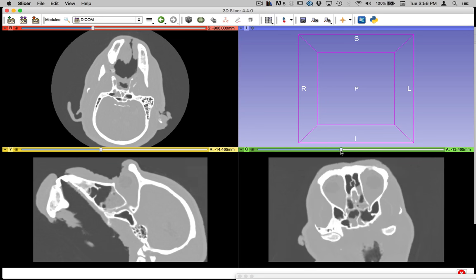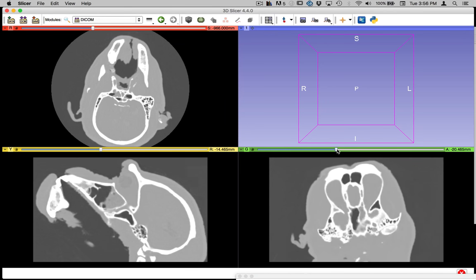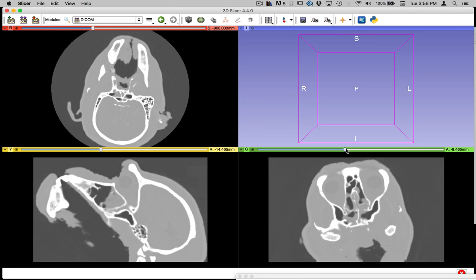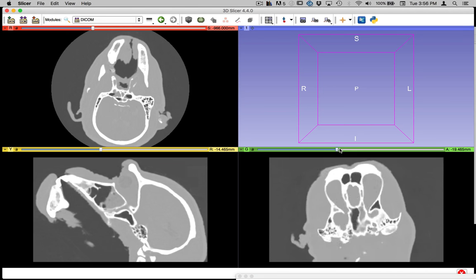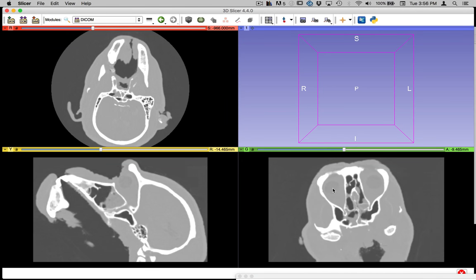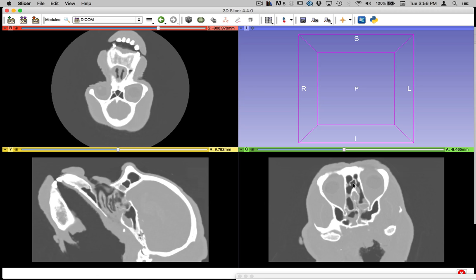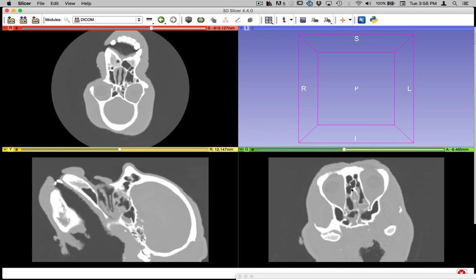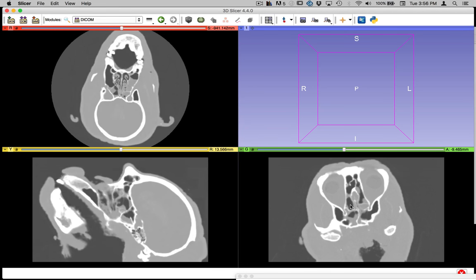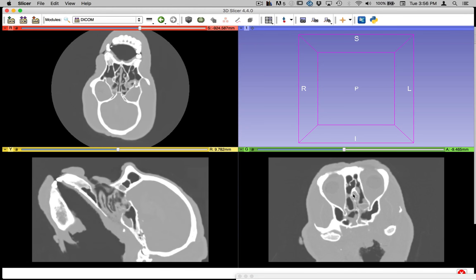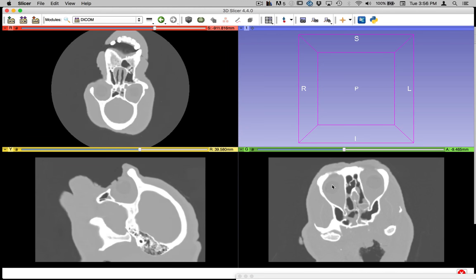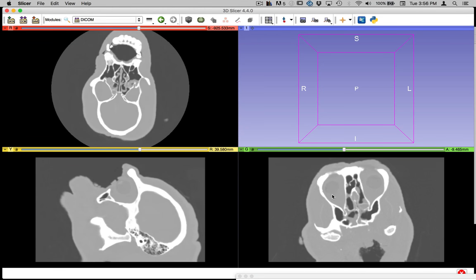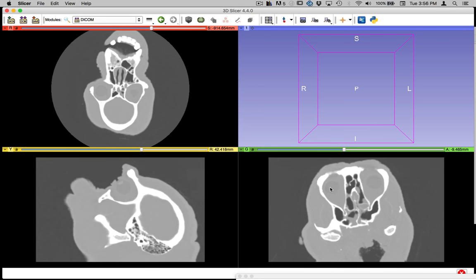And if you are scrubbing through and you find something of interest. So here we're seeing what look like the ethmoidal sinuses. If I want to see that on the other images, if I hold down shift, then move my mouse over the green slice here, you can see the other ones trying to keep up with what I'm looking at here in the image. So if I move over to the orbit, you can see the sagittal section is moving into a section through the orbit, where you can see part of the eyeball here.